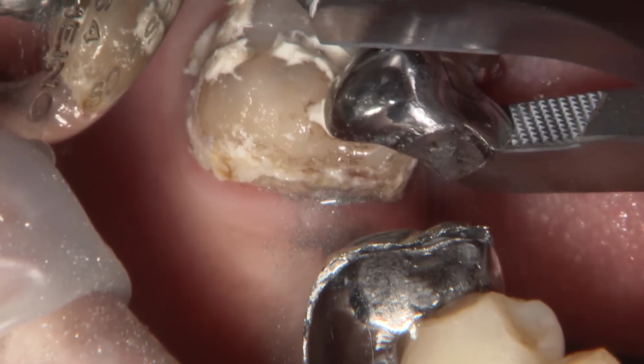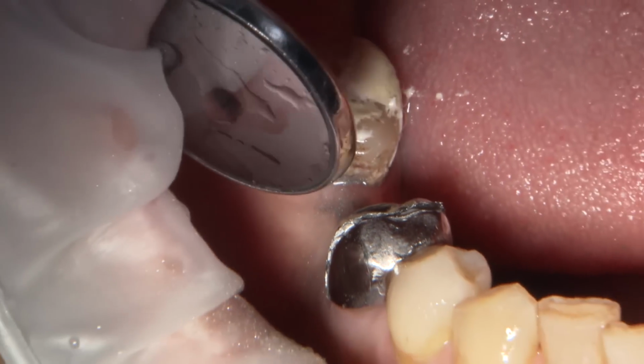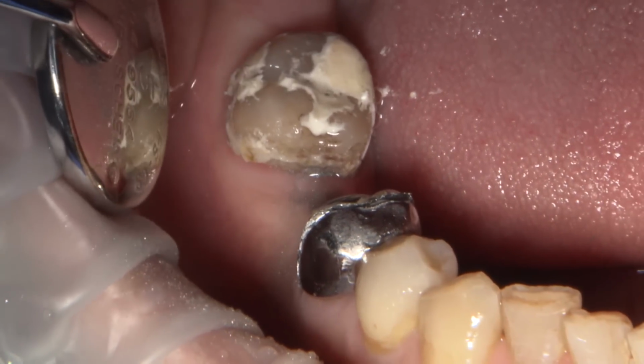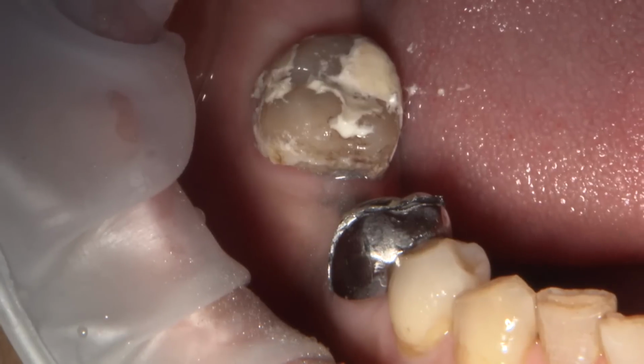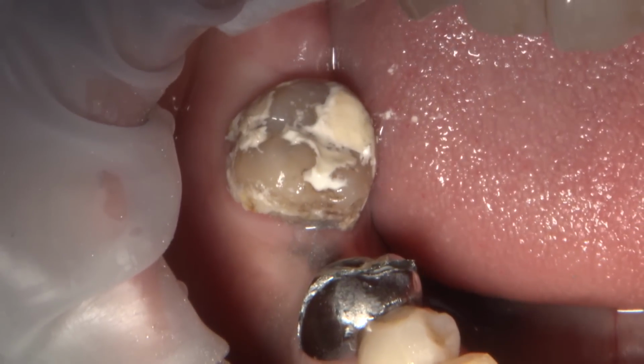After removal of the metal prosthesis, I noticed that not much preparation was done on 31. The mesial marginal ridge of the enamel was still present, and the mesial inclination of the tooth created a significant undercut on the mesial of number 31.